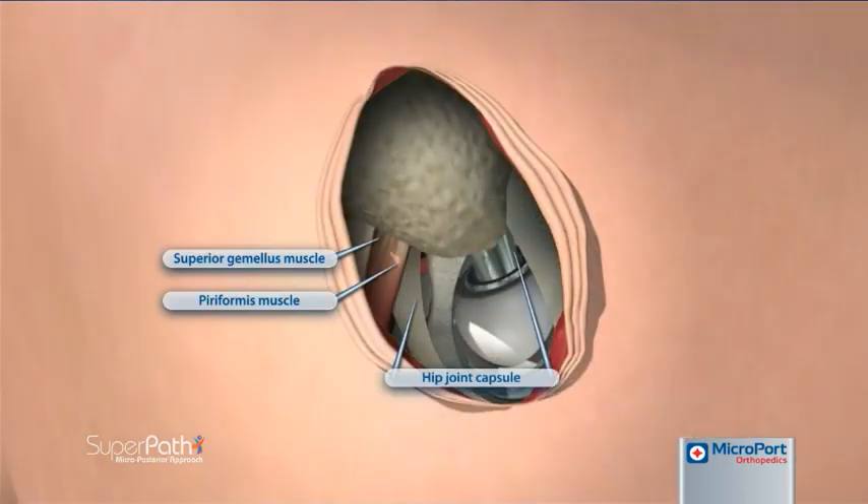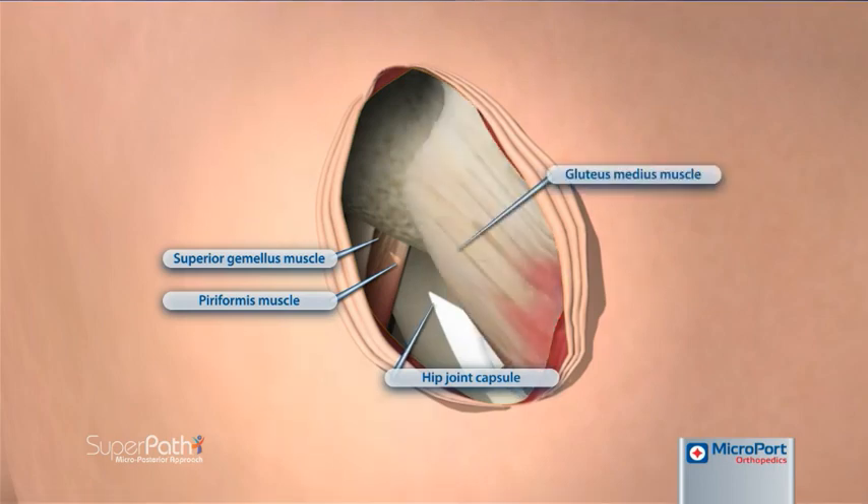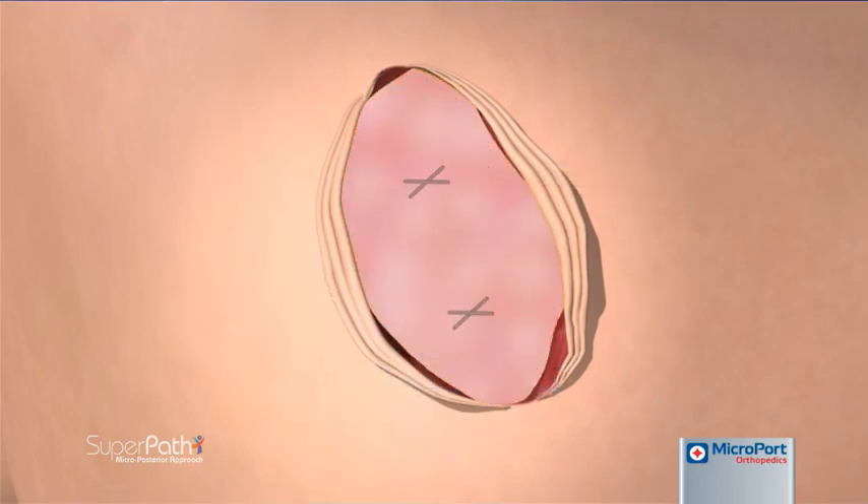Closure begins by approximating the joint capsule superiorly and inferiorly. The remainder of the incision is closed in standard fashion.